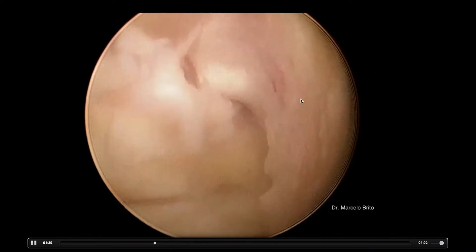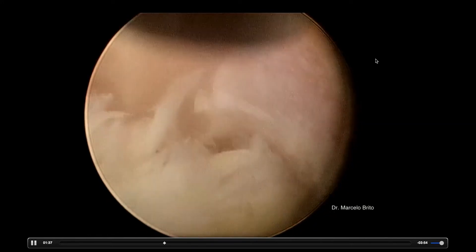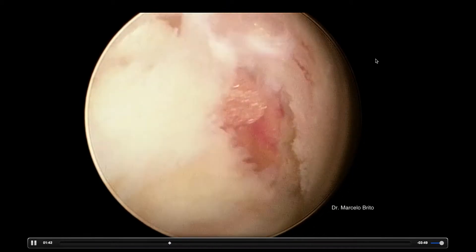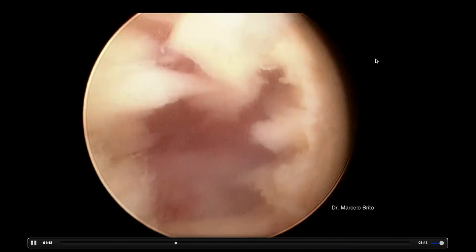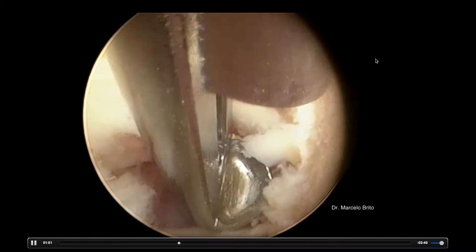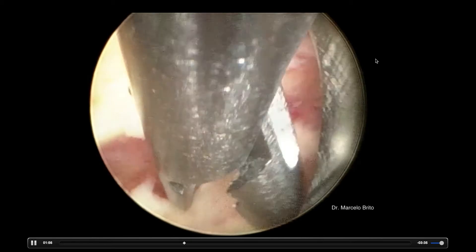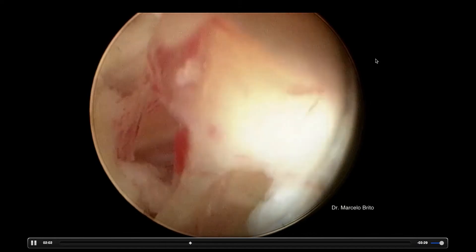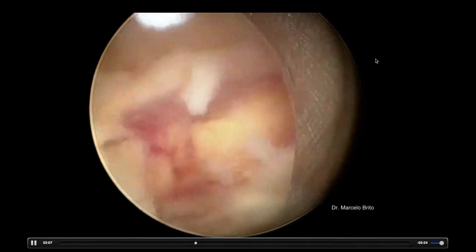We see now the top of the canal, and we can complete the decompression with our Kerrison, with a punch, scissors, or any other instrument you are used to. We're going to take now the yellow ligament. We can start to see the dural sac — a nice image of the dural sac — and the yellow ligament being removed from the upper lamina, from the facet, and from the lower lamina. Sometimes you take it in parts, and sometimes you can take big parts of the yellow ligament.